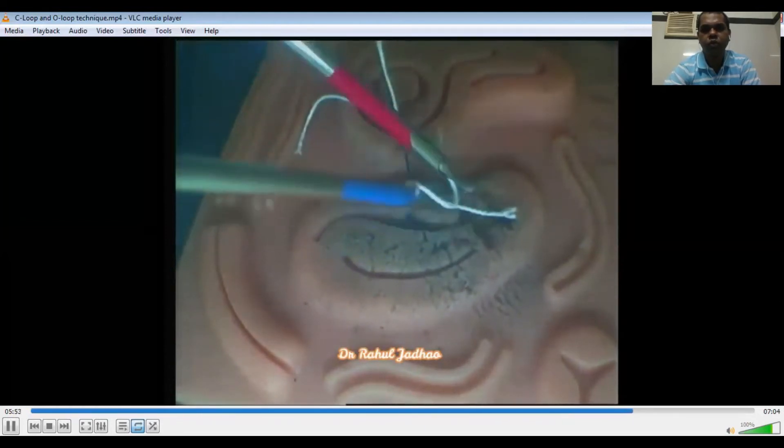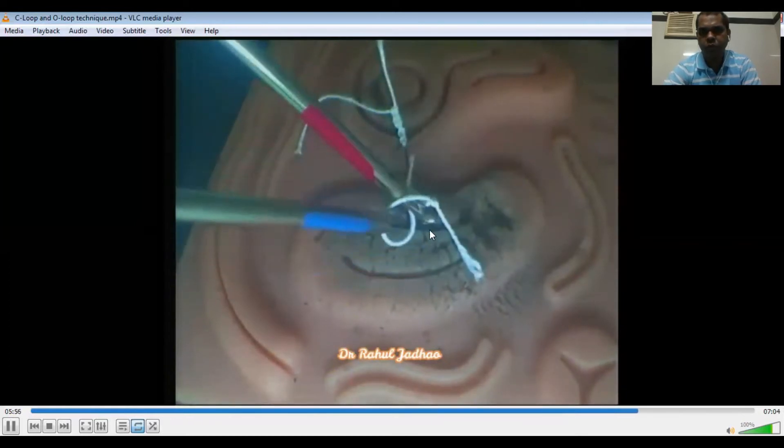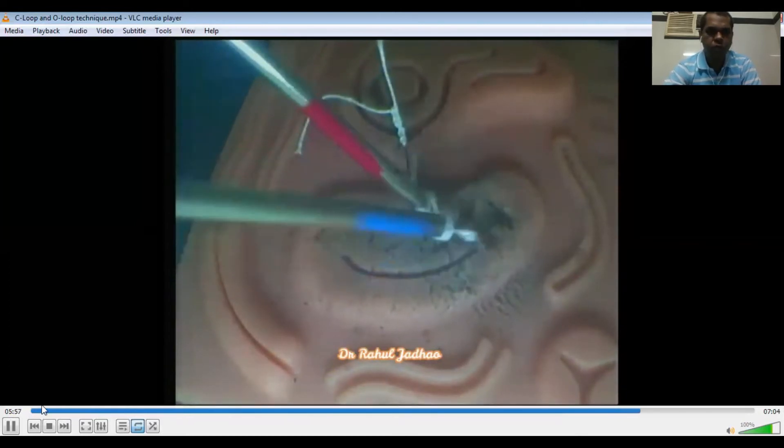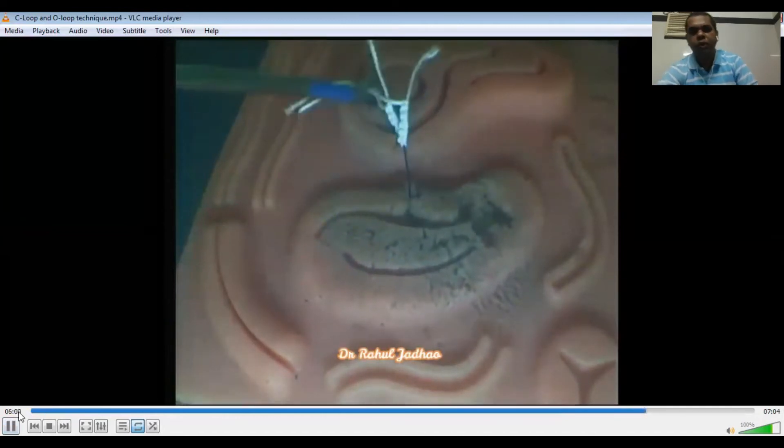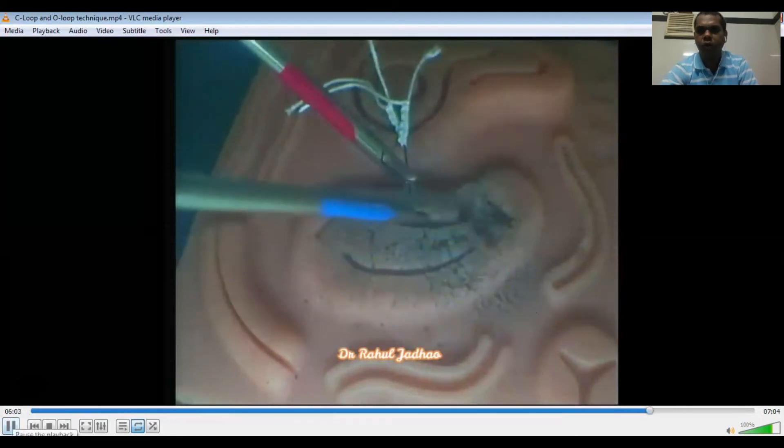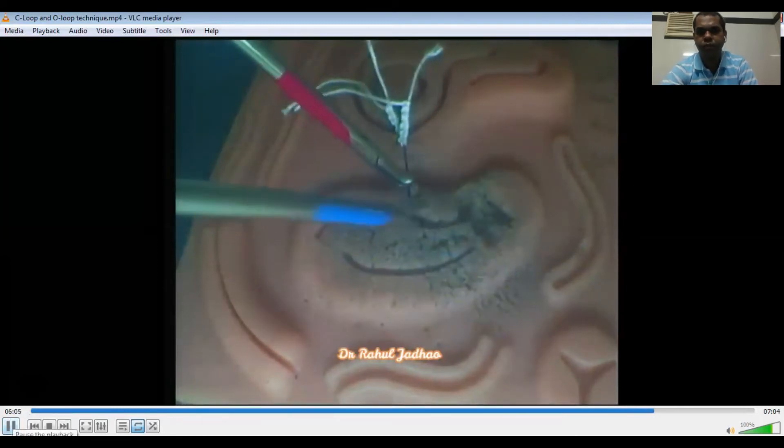Using this O-loop technique, when we keep the jaw of the right needle holder open, that is called the thumbs-up technique or gladiator technique.